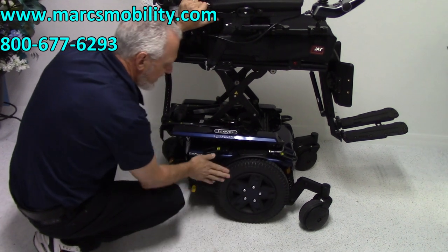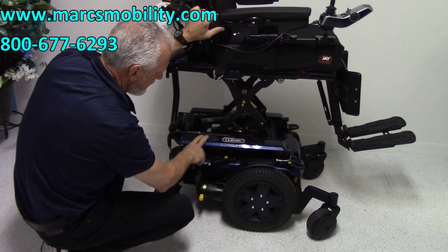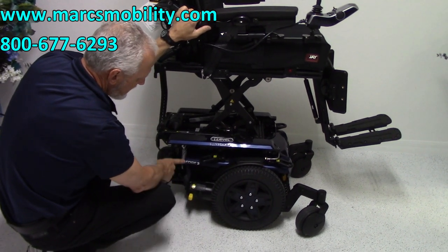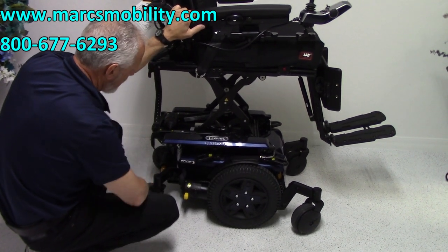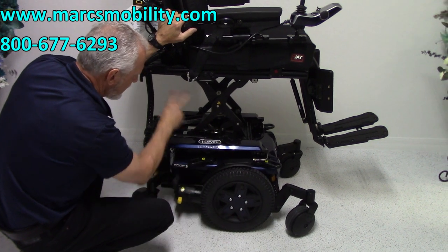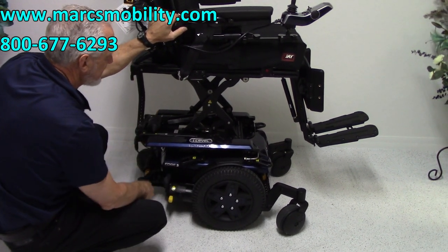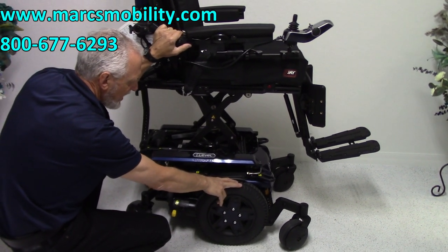We've got 14-inch solid wheels with matching colors on the top, middle, and on the wheel. You can see it's an Edge 3. Castor wheels in the front, castor wheels in the back. You've got a motor for each wheel, like all power chairs, so there are two motors total — one on each side. This chair weighs probably 350 to 400 pounds.